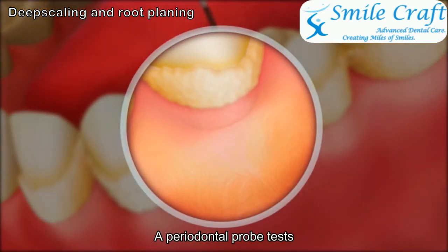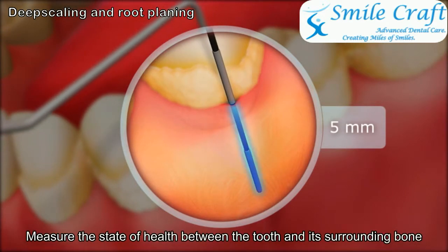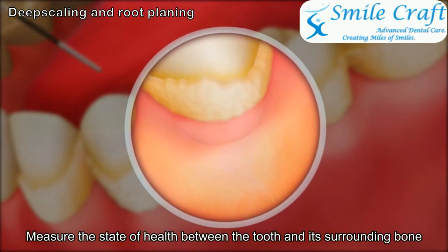A periodontal probe tests the depth of the gum pockets. This will help the dentist measure the state of health between the tooth and its surrounding bone.